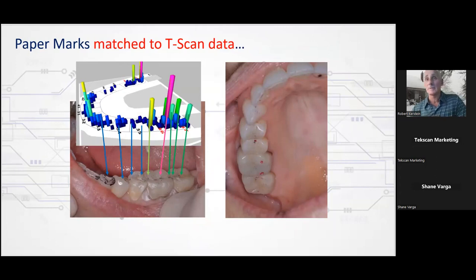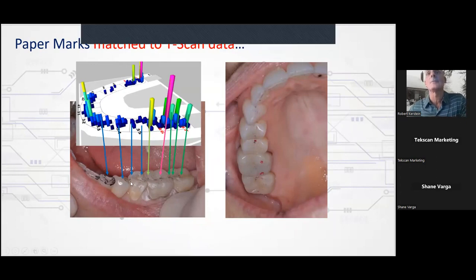That doesn't mean they're the same force, as you can see in this example. But if I want to refine them further after making them the same size, I know that this one needs a reduction. I know that this one needs a reduction further. I want to get them down to blue, right? Blue or light blue.